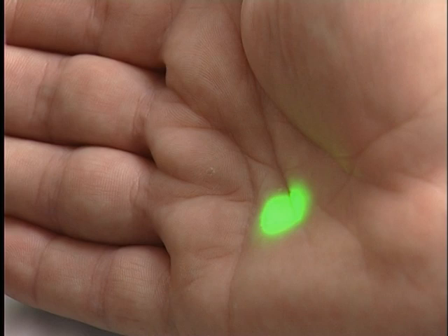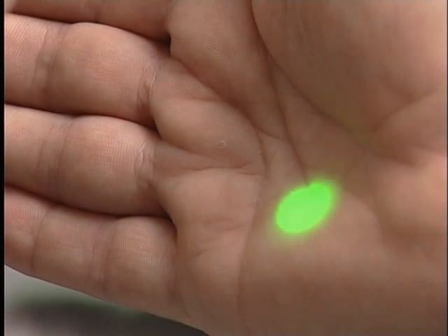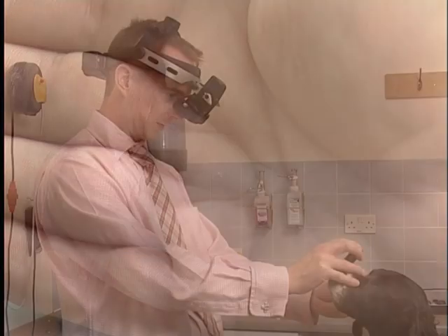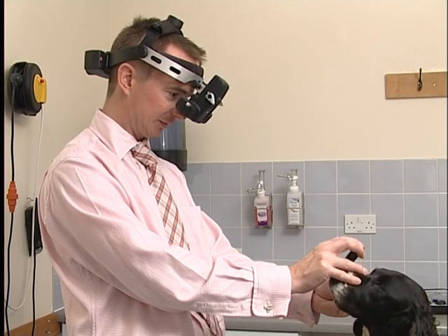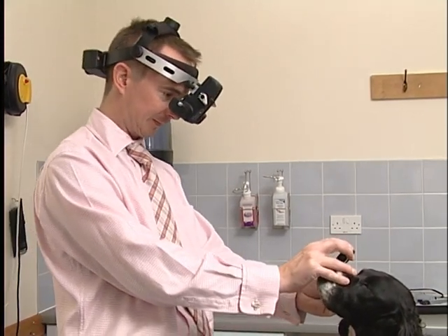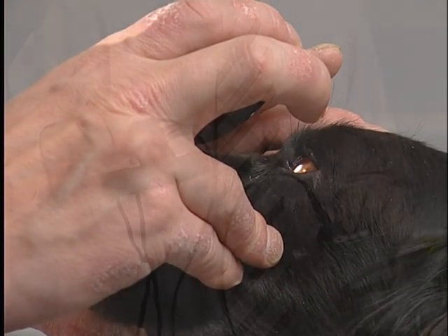On many of the head-worn binocular indirect ophthalmoscopes, a diffuser is present. This unique extra-wide beam of diffuse light permits a more relaxed technique during more challenging fundic examinations. Beginners may also find this aperture particularly helpful, since the alignment between the headset, the condensing lens, and the pupil in order to achieve a full lens image is not as critical as with the conventional beam.